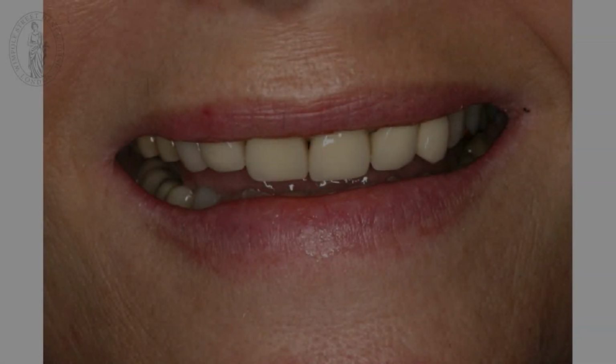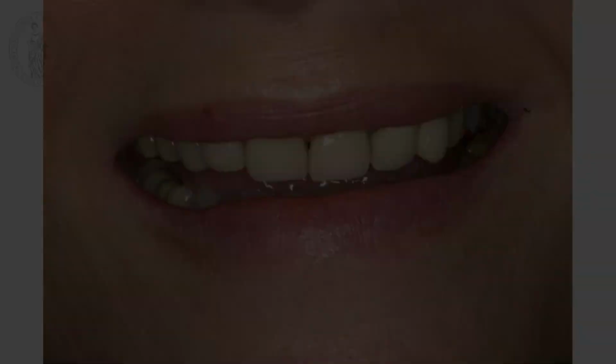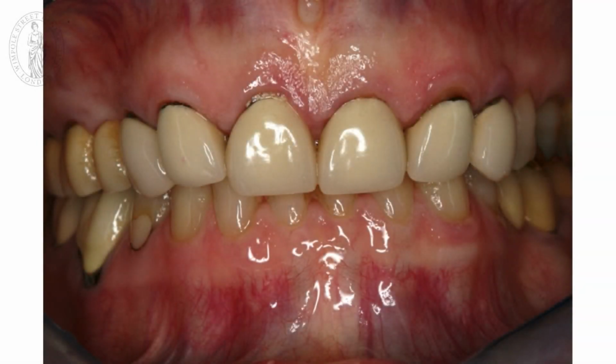What we do nowadays is full ceramic bridges. We have new materials since several years which have been scientifically proven to be completely adequate and even better than metal ceramic versions for restoring situations where teeth are missing. So we have a patient here, initial situation, not happy with the front crowns, they're rather old, and she could see the margin had a small decay on the margins as well, so she wanted to have just a beautiful normal smile again.